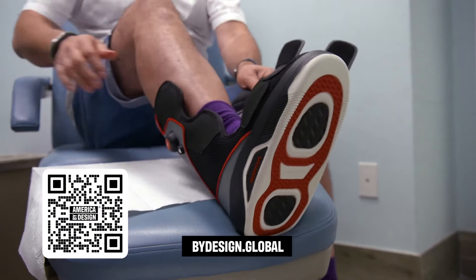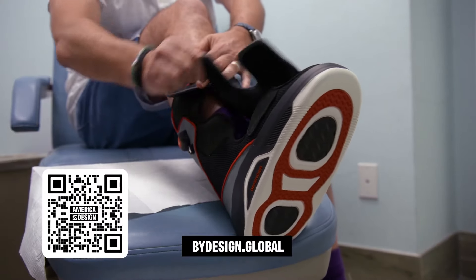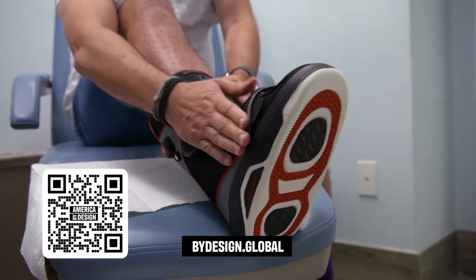The Foot Defender is a beautiful blend of design aesthetics and biomechanics that has the potential of preventing thousands of amputations from ever happening.